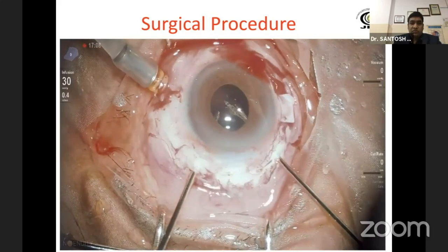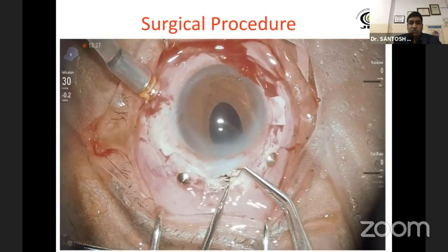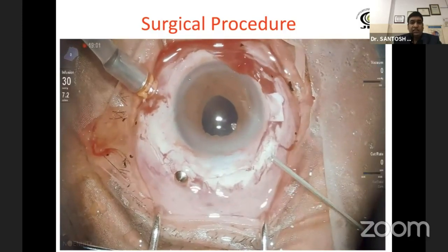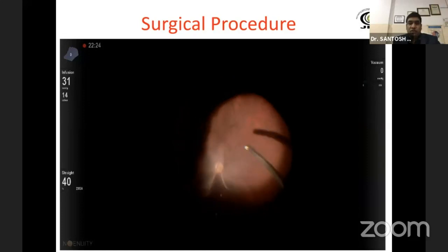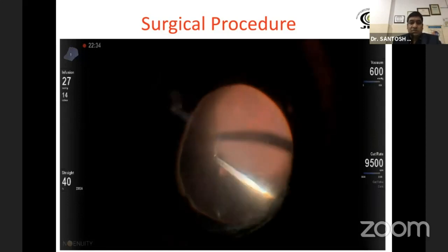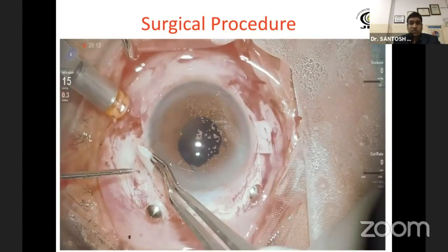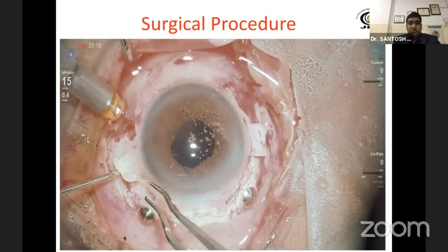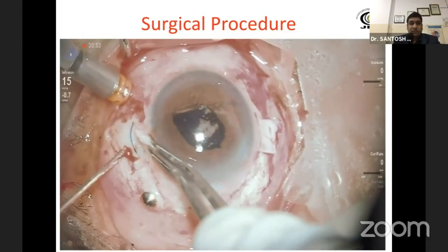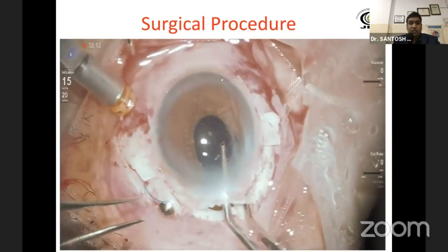The IOL has been taken out with vitreous forceps with the help of two hands, just like a handshake technique. I guided the IOL into the anterior chamber, taking care of the iris. You need to remove it and then clear all the vitreous and iris margin. I proceed to make a complete PVD and clear all the vitreous, which not only helps to ensure proper insertion of the IOL but also prevents retinal detachment in future. You can see this is a case where I was trying to put the IOL in the sulcus but it was going down, so I took care of the haptic and tried to rotate the IOL to bring it into proper position.